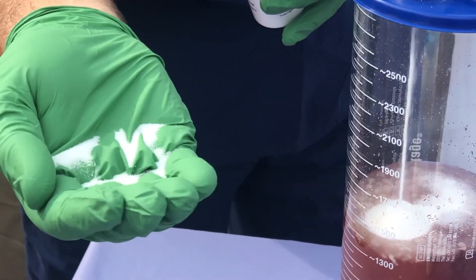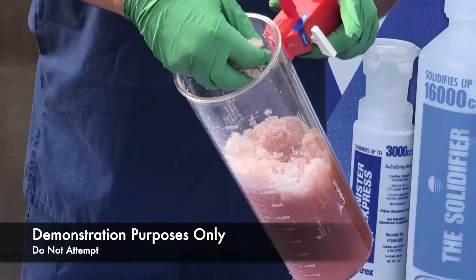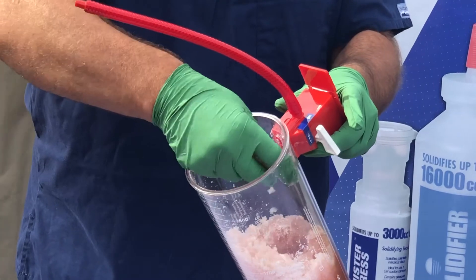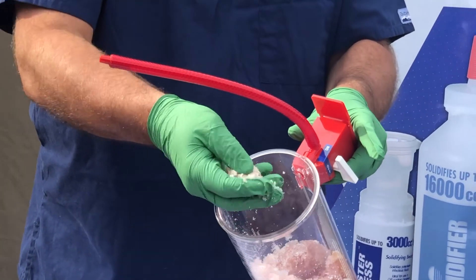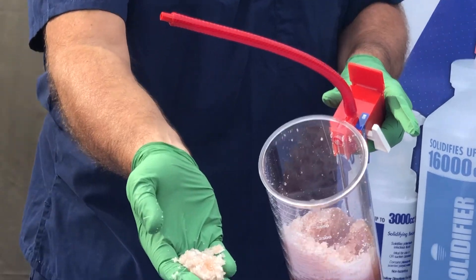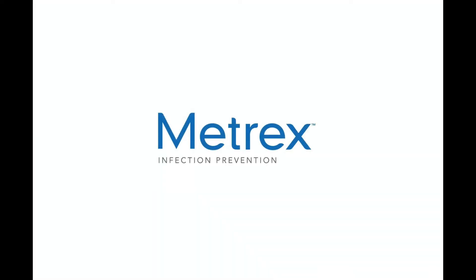The makeup of the Canister Express contents can be seen here. For demonstration purposes only, we've opened up the suction canister to show what's become of the liquid waste. It's now solidified and safe for transport and disposal within the canister.